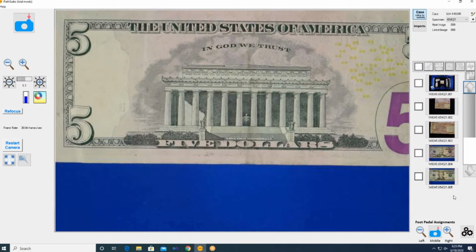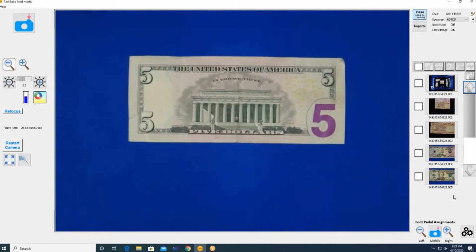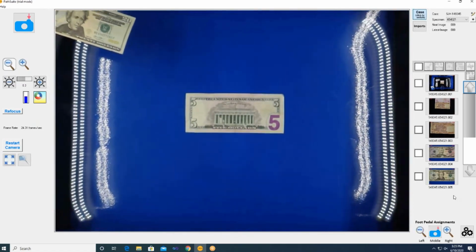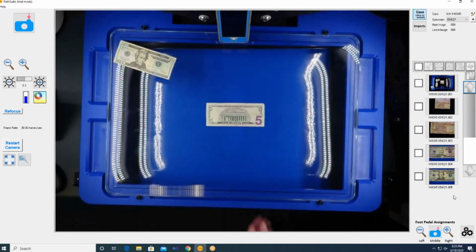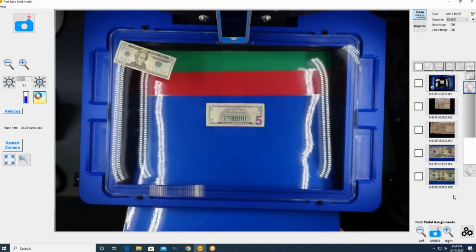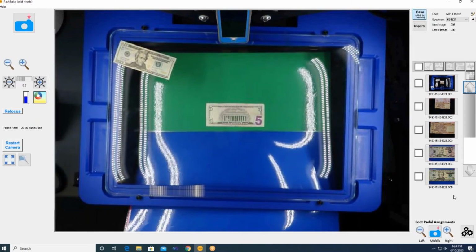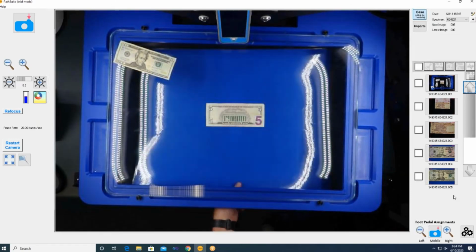And so this is our live mode. With live mode, we can adjust the field of view by zooming out. I'm going to zoom all the way out, and so this is the smaller glass board. It's good for medium and small size specimens. You can see in the background, I can change the background color very easily here, so you can select what type of background you would like to have.